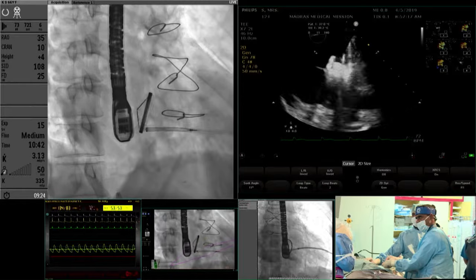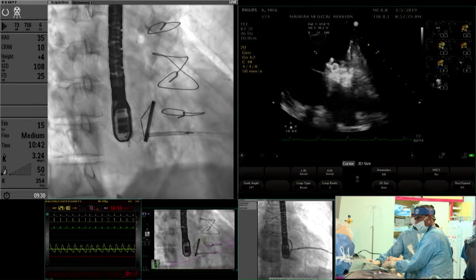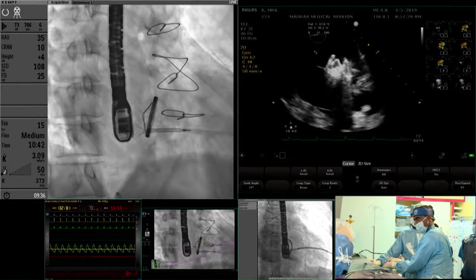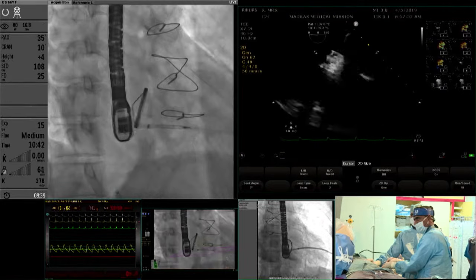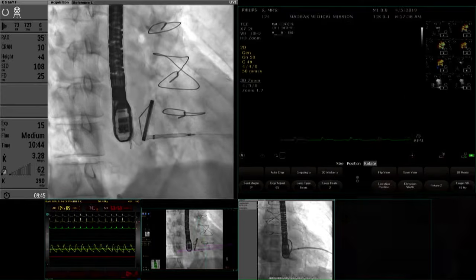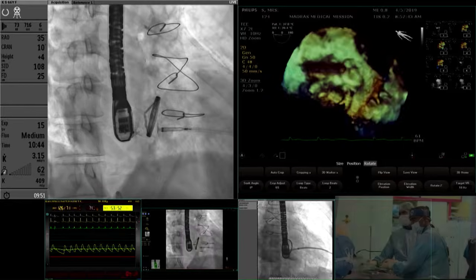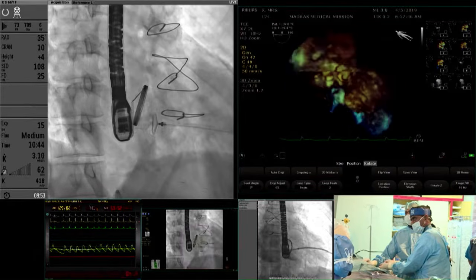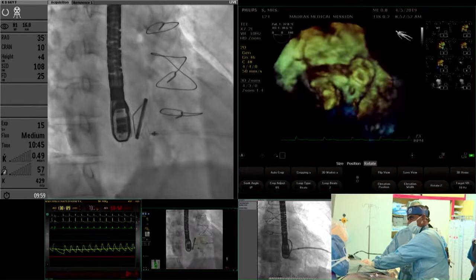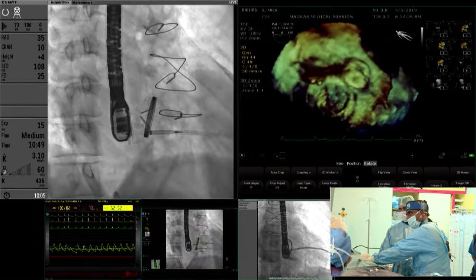It's nice to see both the imaging modalities up here, because at this stage when I'm putting these things in, I'm really looking at the transesophageal echo more than anything else, about how it lies and whether it's deploying well. Srija, you are happy with the pictures? Yeah, yeah. An excellent demonstration of how the three parts of the device are being deployed also. It's slipping out. However, 16, maybe because the leak is a little larger, I will try to see if I can center it onto the middle.